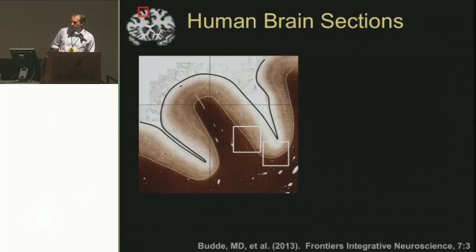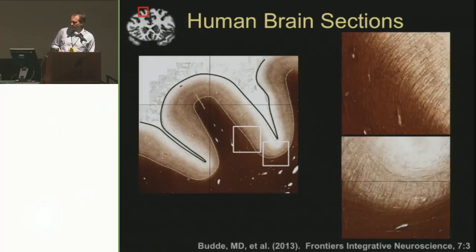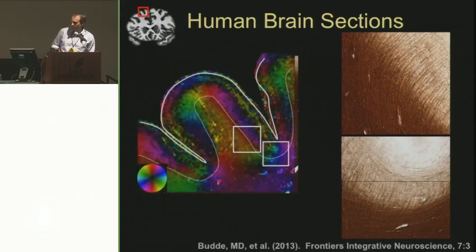Looking at the cerebral cortex here, a few things jump out at us as well, and that is that fibers that enter a gyri in the white matter typically take very sharp angles into the banks of the sulci. Even at the deepest part of the sulci, you can see some fibers that are horizontally oriented and some that are radially oriented relative to the surface of the cortex. If we color code this again, this highlights in more detail anything along that white matter, the dotted line there. As it enters the cortex, it takes a very sharp turn. So that's one thing to consider as well.